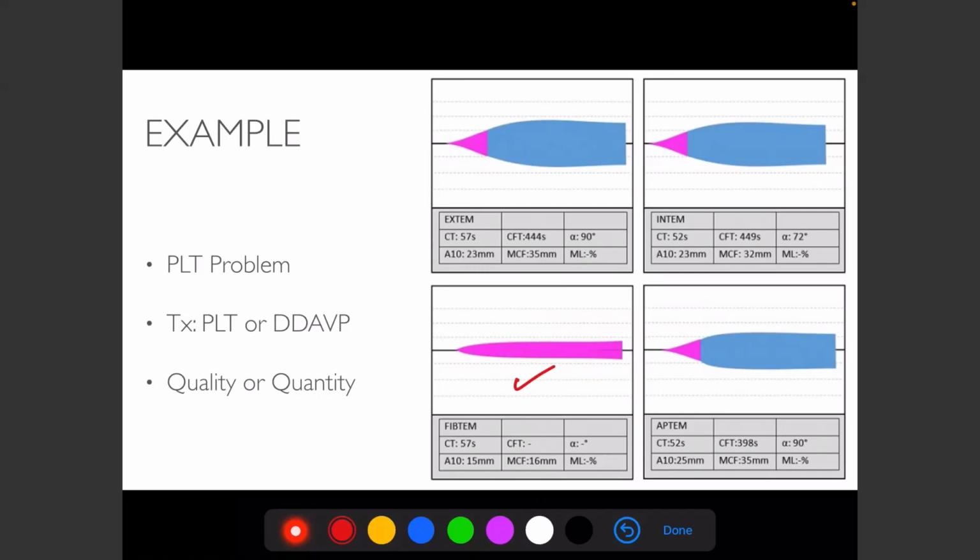Or say somebody comes in and they have acute coronary syndrome and you're wondering, are they actually taking their dual antiplatelet at home or not, that they were on 6 months ago? And they have a completely normal Rotem, they probably weren't taking it. So maybe you should reload that patient. So that's another way that you can use this. Obviously that's not data proven. Or the Plavix washout. So say somebody has Plavix as a home med, and they need to wait the 5 days, but then you run these and they really don't have any antiplatelet effect for whatever reason, then maybe you can move up that surgery a couple days, and it's better for the patient to not be sitting in the hospital for an extra 5 days.